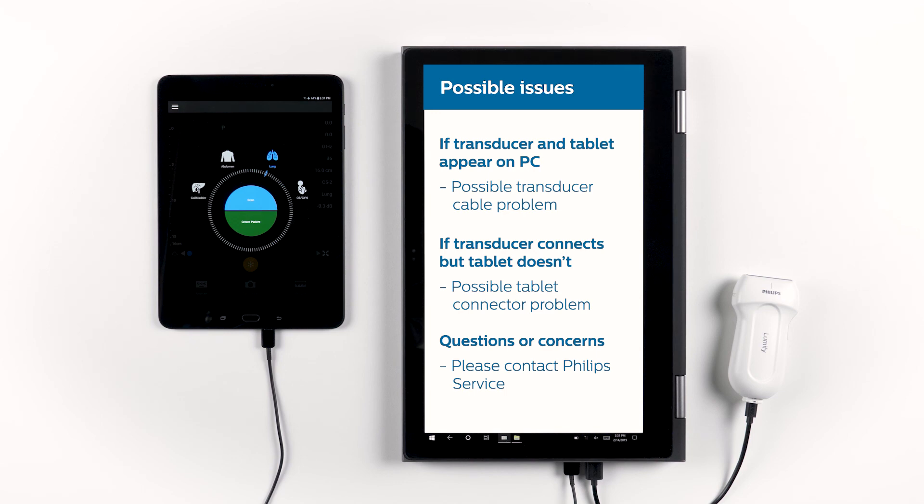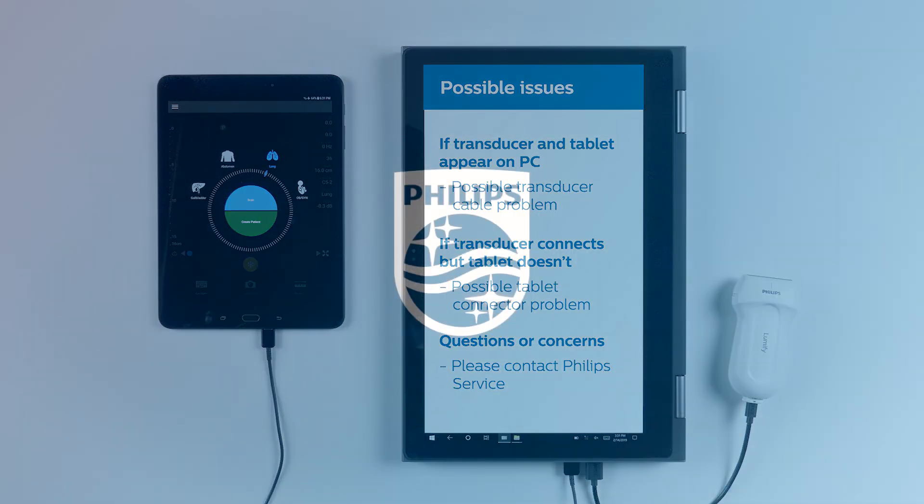It's very rarely the case that there is a transducer problem. While some of these tips may be helpful in some cases, never hesitate to get in touch with Philips service if you have any questions or concerns regarding your Philips Lumify system.